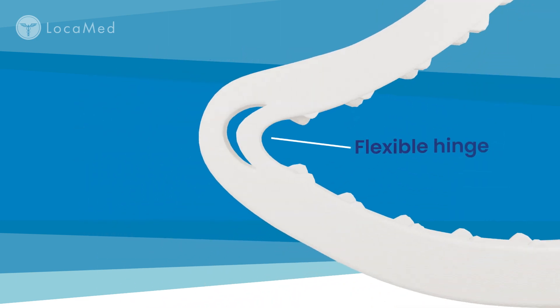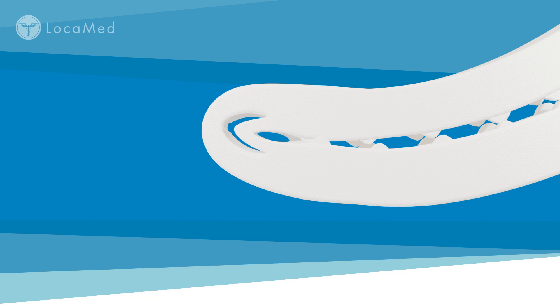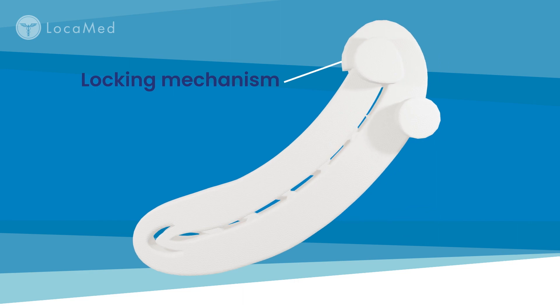The flexible hinge adapts to tissue thickness, allowing even tissue compression within the closed clip. The locking mechanism engages and securely holds the clip onto the vessel.